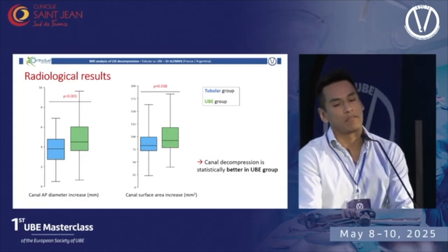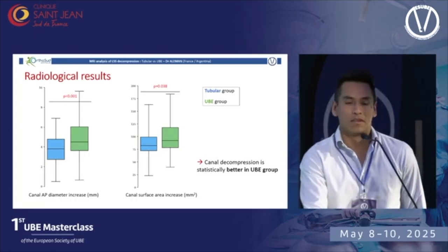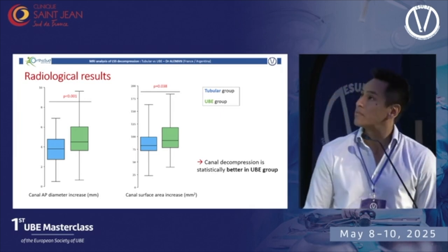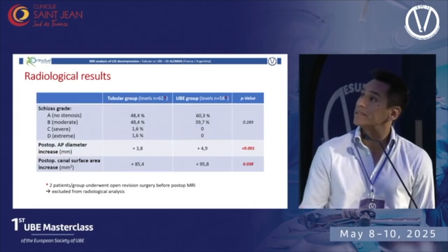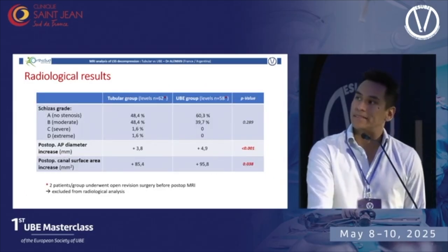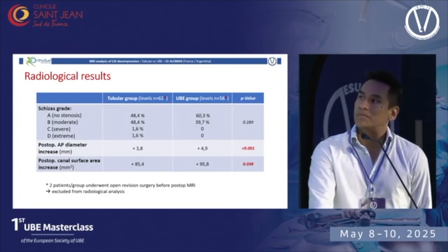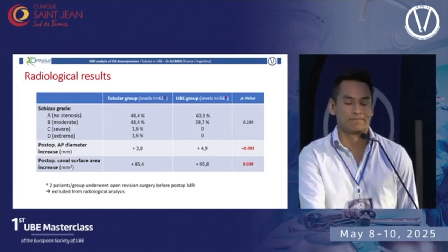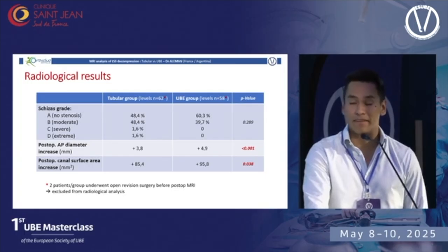For the radiological results, we can see UBE provides a better decompression, with a greater increase in the anterior-posterior diameter and in the canal surface area.